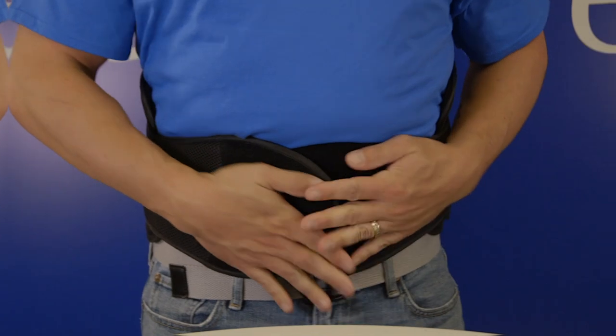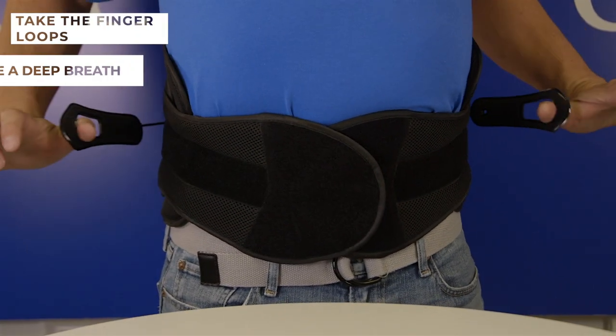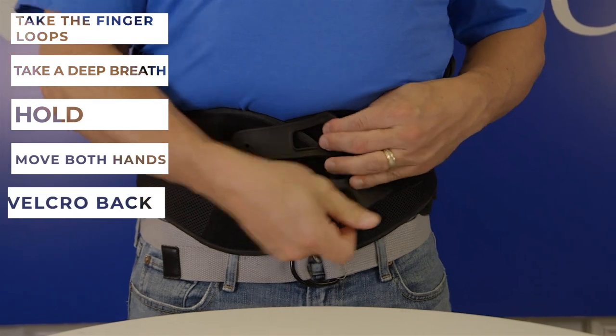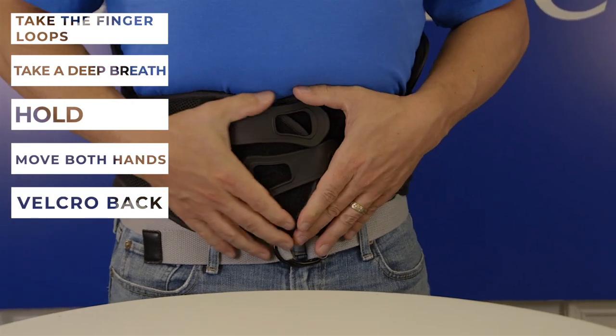Once you have the correct fit, take the finger loops in each hand, take a deep breath and hold, then move both hands with the loop out to the side of your body and velcro back onto the belt. You are set and ready to use this brace.